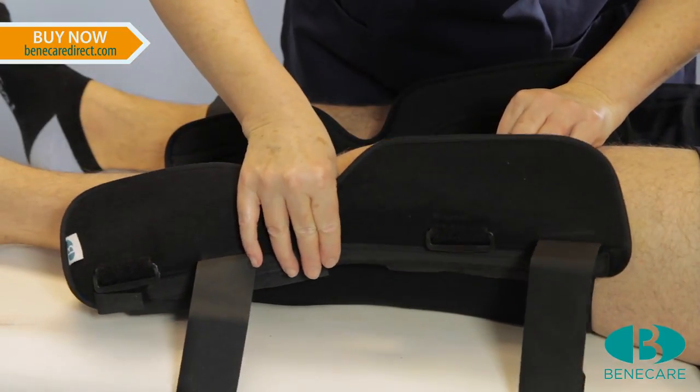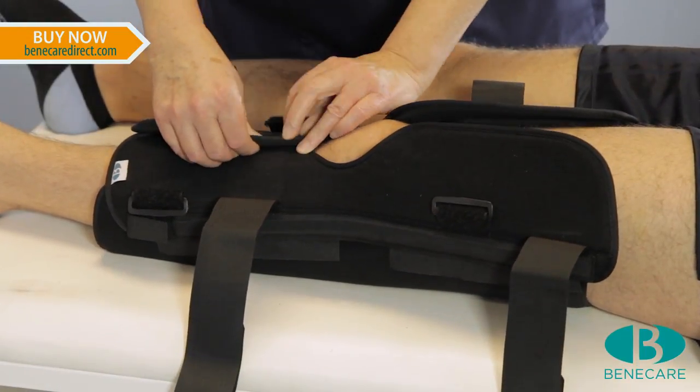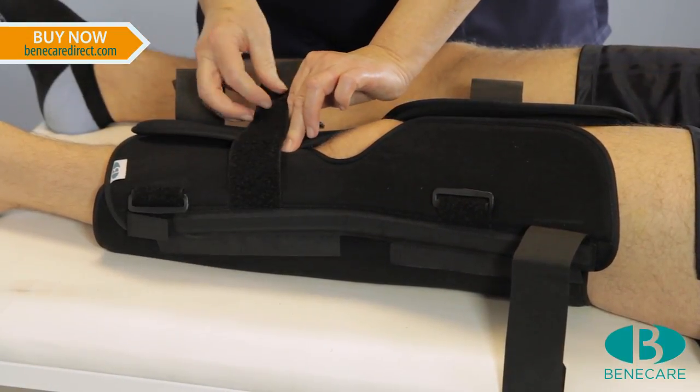Repeat this procedure with the lateral stay. Secure the splint to the limb using the circumferential hook and loop straps.